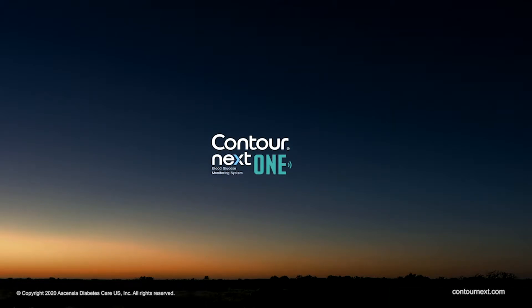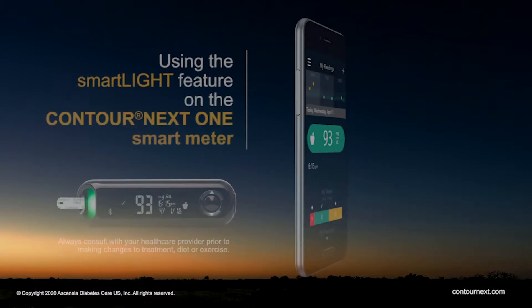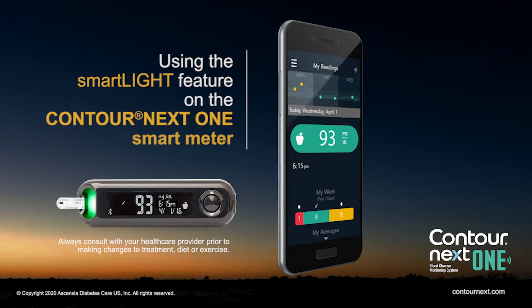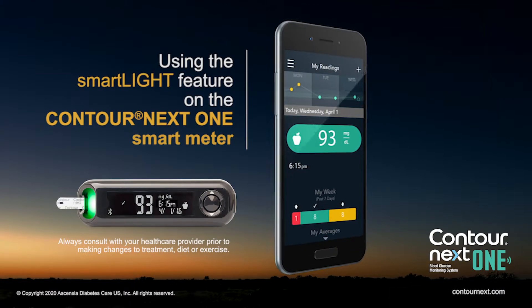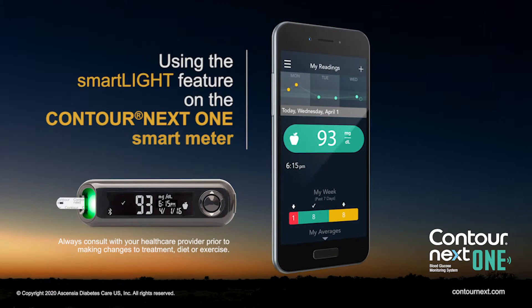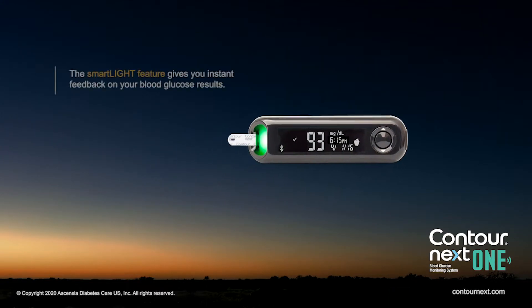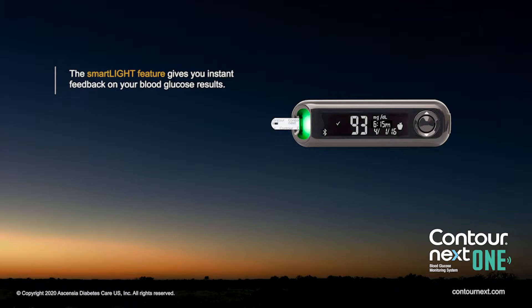ContourNextOne Blood Glucose Monitoring System. This video will show you how to use the SmartLight feature on the ContourNextOne smart meter. The SmartLight feature gives you instant feedback on your blood glucose results.